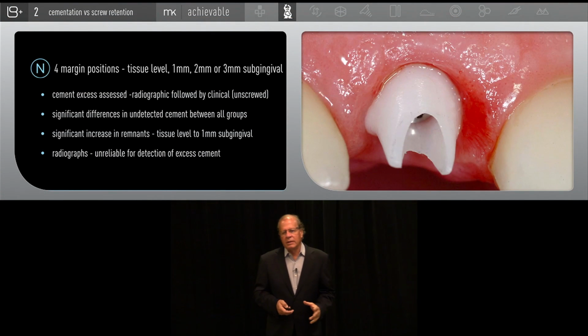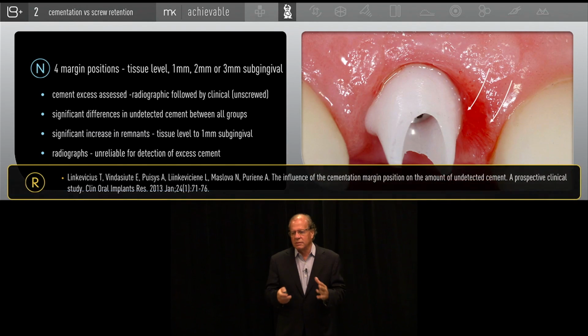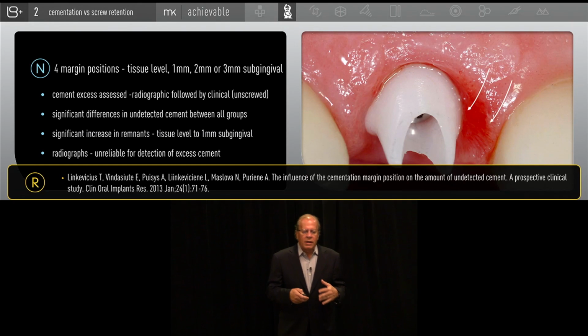So just to give you an idea, why abutment design, whether you're doing it digitally or otherwise, analog, is so important is because if your abutments are not designed correctly, and as shown in this case, quite deep on the distal, if you want to isolate the area, it becomes rather difficult. You try to place a cord gently, and it starts to well up, float around in this area, and then you induce bleeding, and I think the process goes backwards.